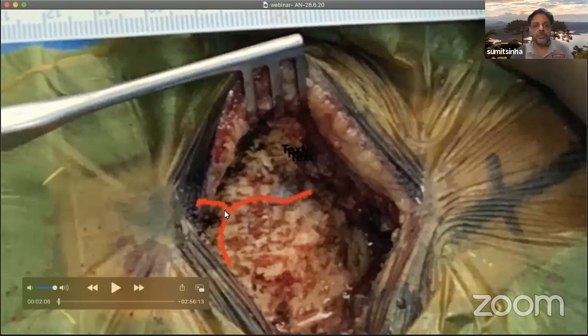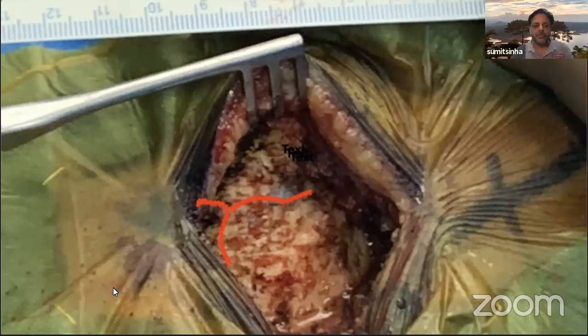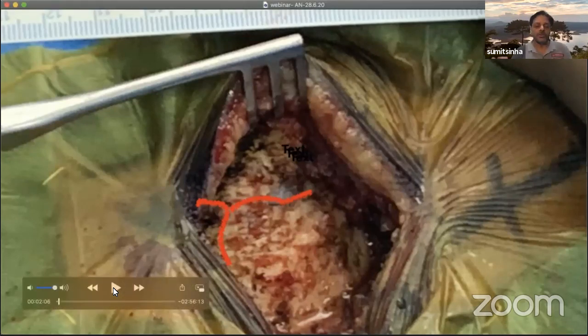The junction or the confluence of these sutures is the presumptive location of the sigmoid transverse sinus junction. And it is here that you have to place your first burr hole while making a craniotomy. I always prefer to make a craniotomy and then replace the bone flap once the surgery is complete. Of course, it has its advantages over a craniectomy. The incidence of a post-craniectomy syndrome is negligible or almost none if you make a craniotomy bone flap.